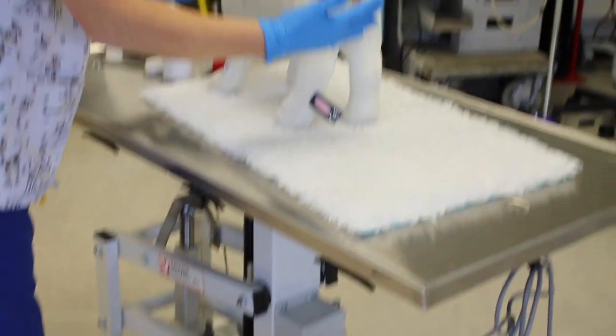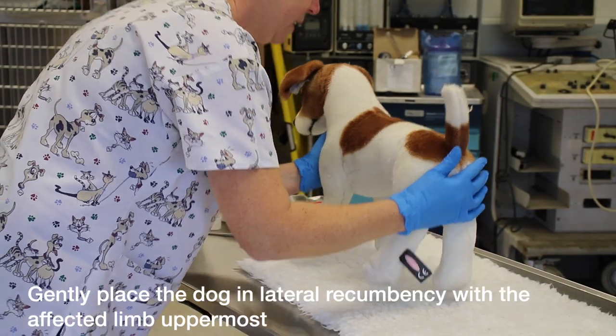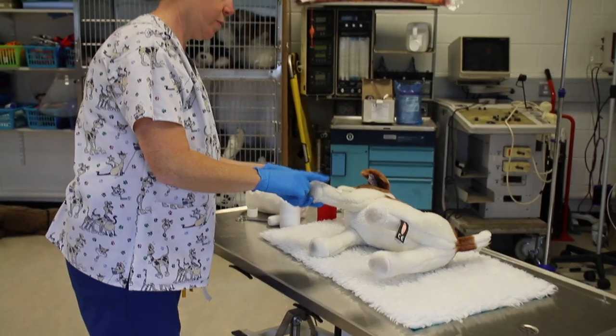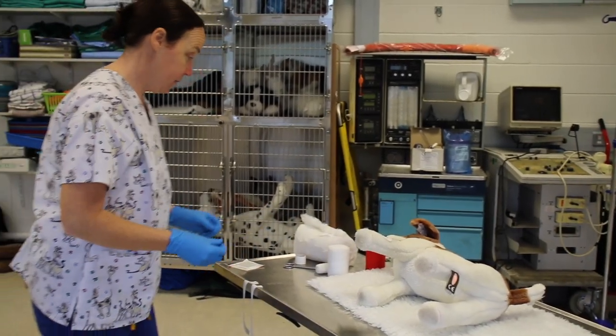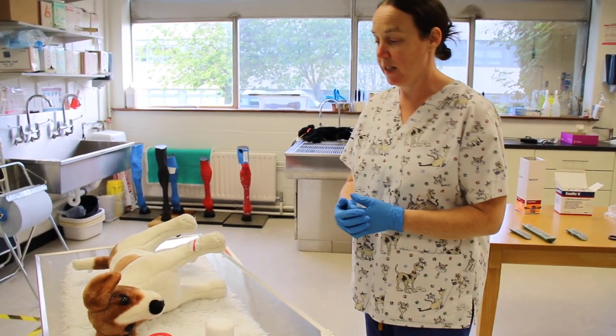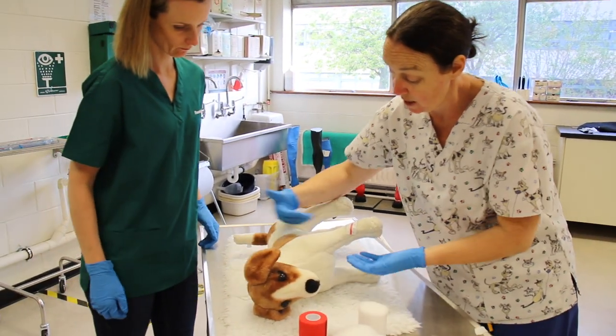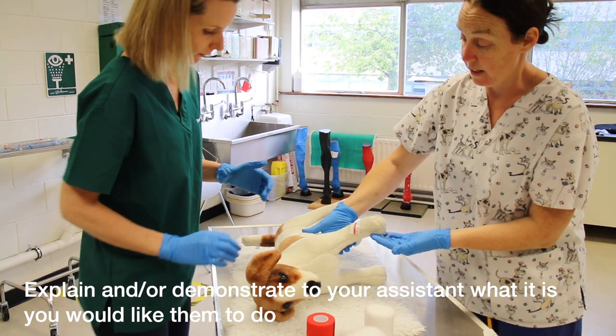We have to place our patient into lateral recumbency. Very gently, you're going to place him into lateral recumbency and make sure your affected limb is uppermost, because that's the one you're going to be working with. We're going to get our assistant to secure the patient's head and just hold the leg like this.